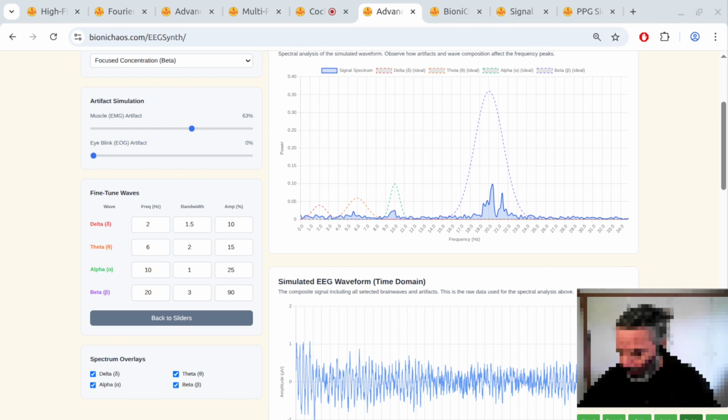Right, so these EEG signals, they're direct signatures of what your neurons are doing. We capture them with electrode setups, could be on the scalp, on the brain surface, or even deeper inside. And then straight away, they get digitized. The core processing happens in, let's say, 3 main ways.